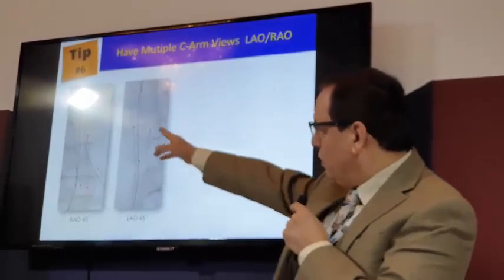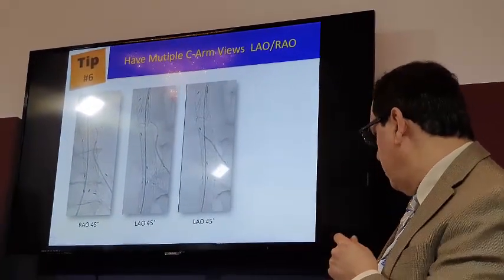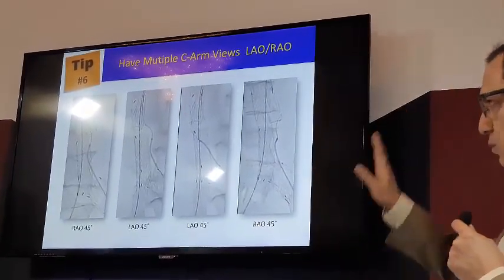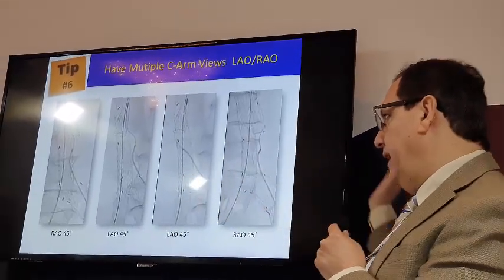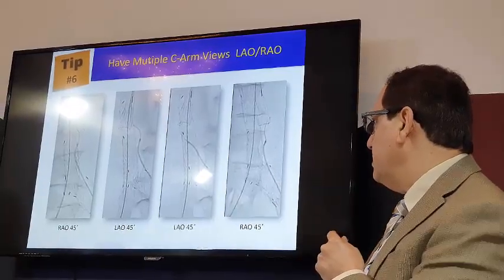Then you push your catheter all the way to where the gate is, here, and then you go back to RAO 45, and you get right away to the catheters. So start with this angulation, go LAO 45, adjust your catheter, and then you'll be right in the spot.